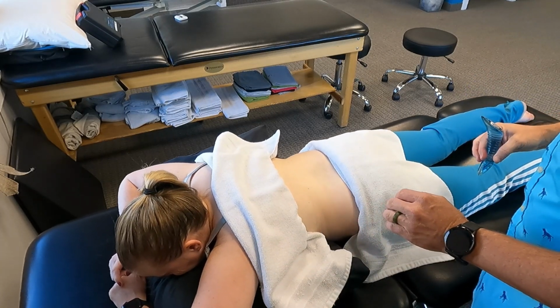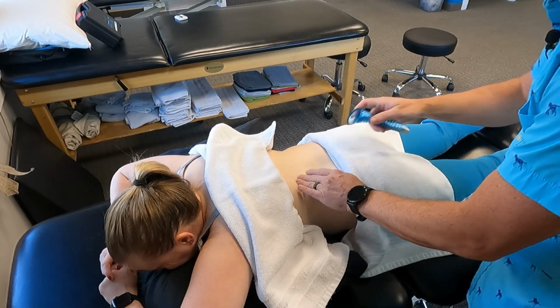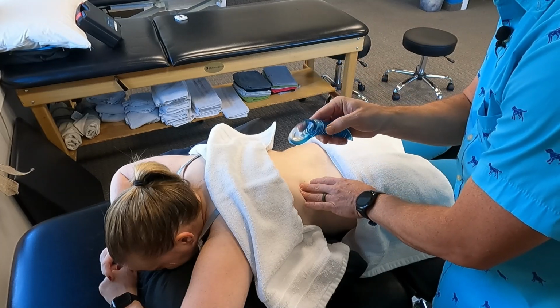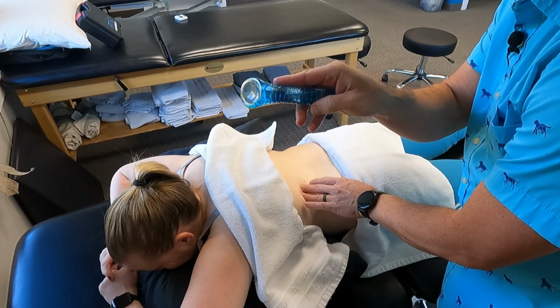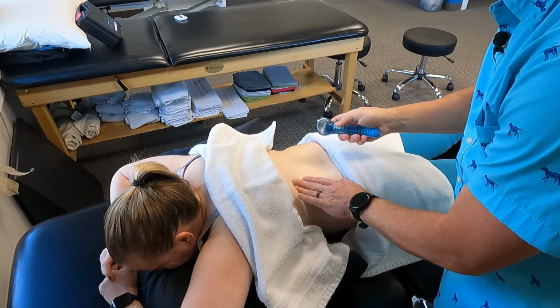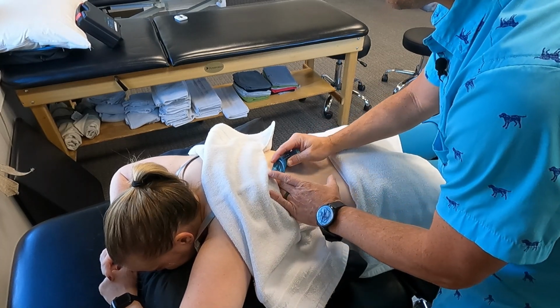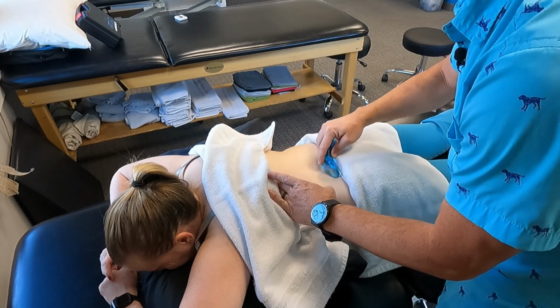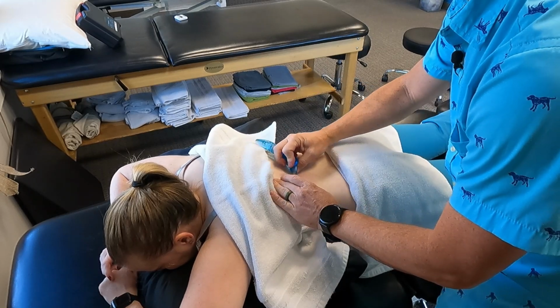And then bring her up a little bit. And then I'm using ASTYM tools, so ASTYM. These are specific tools for soft tissue mobilization. I'm going to use the middle size with that. There are a lot of other tools out there that aren't ASTYM tools, and you can use those just fine. There's a lot of different tools out there.